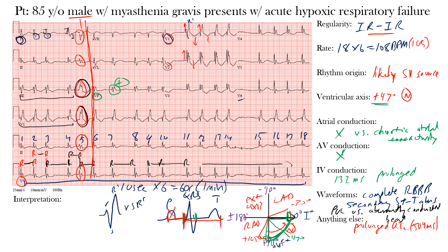For our final interpretation: we have an irregularly irregular rhythm at a rate of 105 beats per minute. We cannot make out any clear atrial or atrioventricular activity. All of this suggests atrial fibrillation with rapid ventricular response (RVR). IV conduction is prolonged due to complete right bundle branch block, which caused the secondary ST-T abnormalities. We also noted the PVC or aberrantly conducted complex, as well as the prolonged QTc interval. Compared to a previous EKG, the only difference was an increase in ventricular rate by 43 beats per minute.